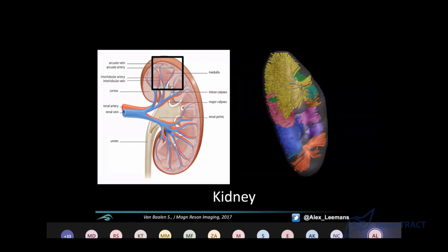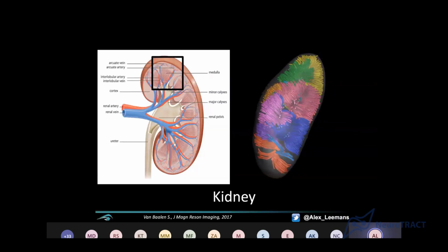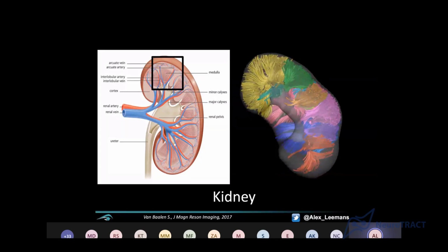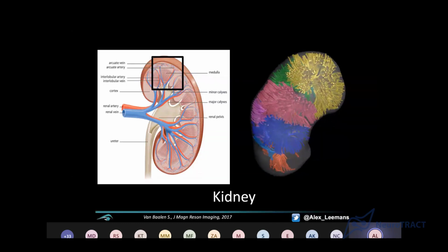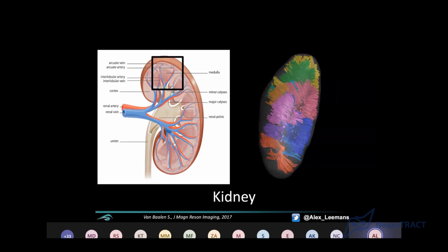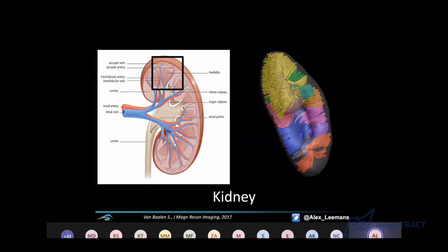And so you basically can now look at these structures and how kidney deficiencies could be investigated. So anything in terms of strategies looking into disease progress or strategies for therapies can now be quantified with diffusion properties in the kidney as well. So that's good news.